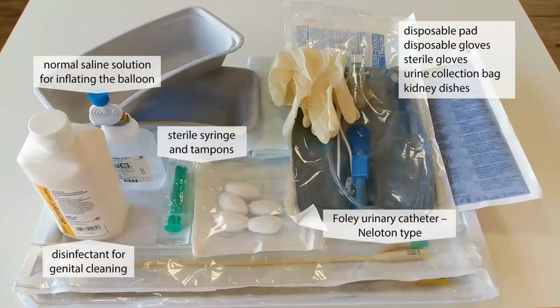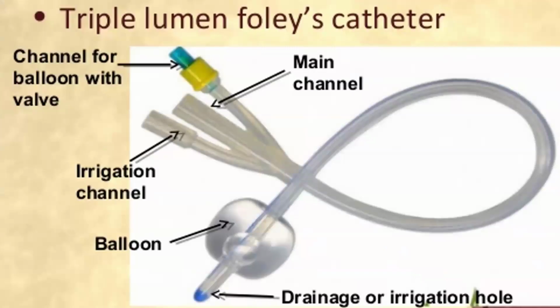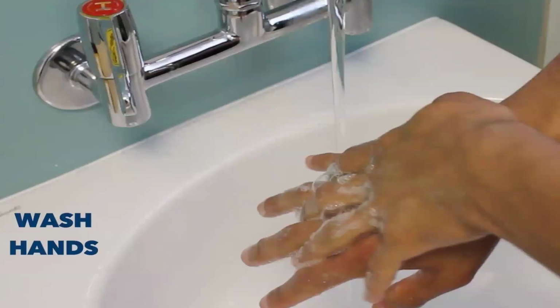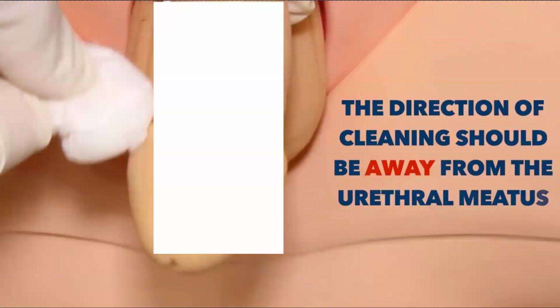Okay, so we'll just go straight into the technique now. First of all, start with exposing the patient adequately. Remember, you need at least one extra person, a nurse, to assist you, and he or she could also be a chaperone. So expose the patient properly, wash your hands adequately, and don your non-sterile gloves for starters.